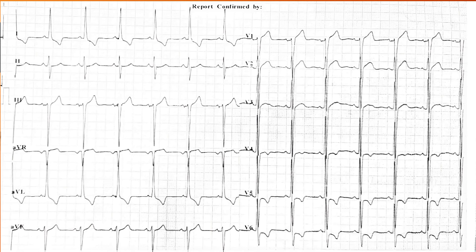This is an ECG of a patient who presented with headaches for the past few months. Looking at this ECG, we can see some complexes that appear tallish — specifically these QRS complexes. The R waves are tallish, the S waves are deeper, along with some changes in the T waves in the form of T wave inversions, which can be seen in leads V5, V6, I, and AVL.